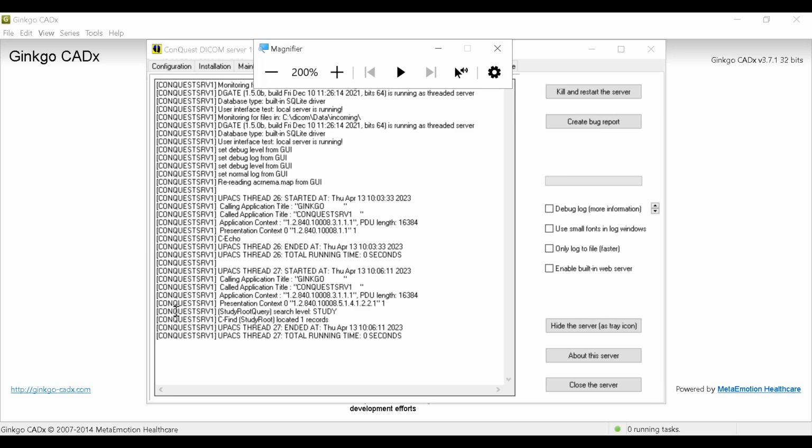Calling title, calling application title. So the AE title that requested it was Ginkgo. It called, it was talking to me, the server. Notice I'm on the server, right? Yes, this is some stuff that tells how it was transferred, and you can look this up in something called a conformance statement, and we'll talk about that later. But just notice that this is just the information as to how it was sent. More important, notice it's searching for a study. It did a C find.